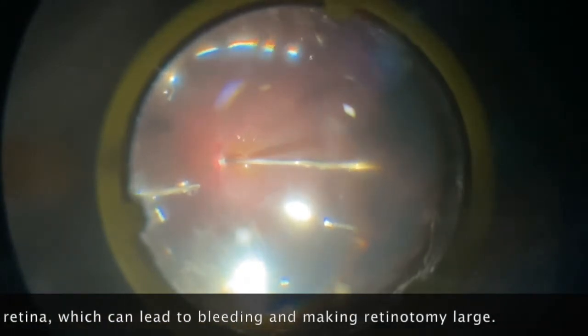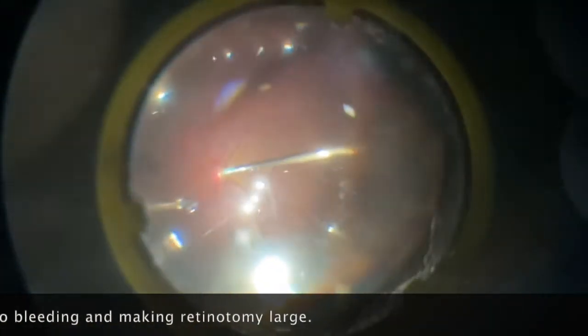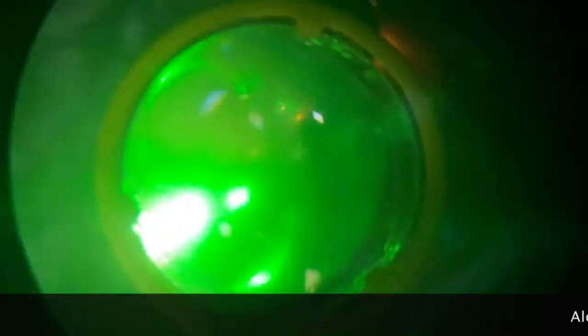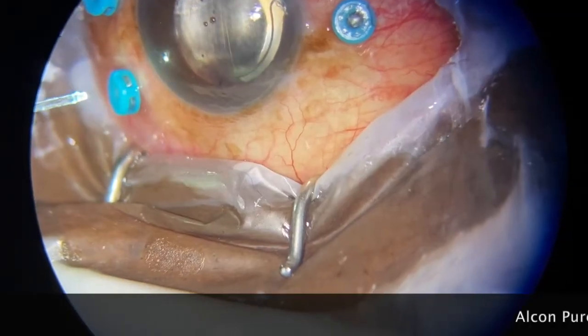I like doing my laser under air. It gives me a wider view, but the downside is visibility. So long as you can see clearly, you have a better way of doing your laser under air. You also have to be careful — the laser mark doesn't show that easily compared to silicone oil.